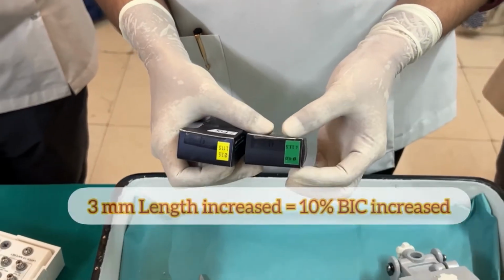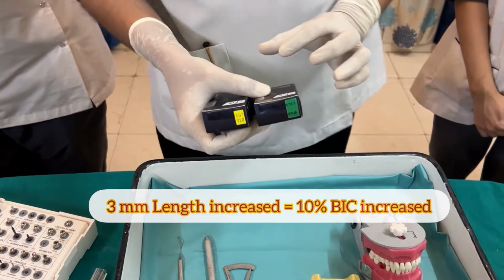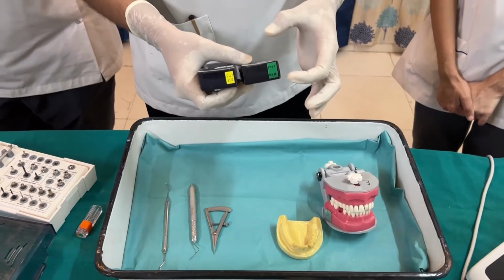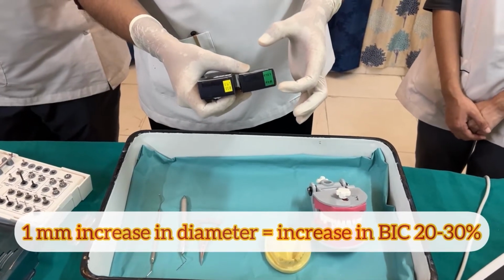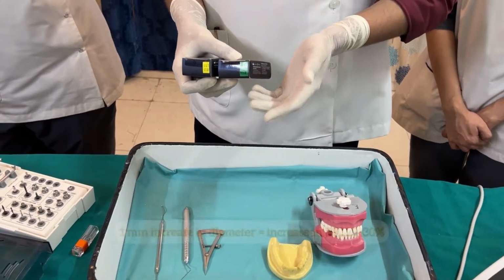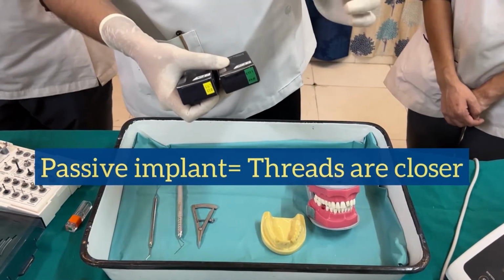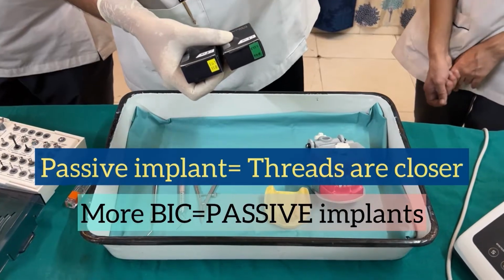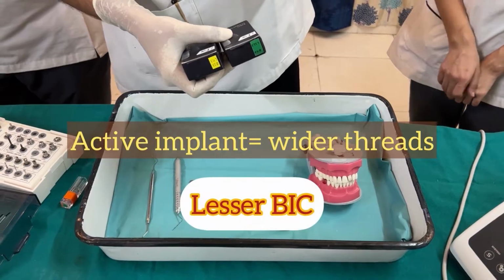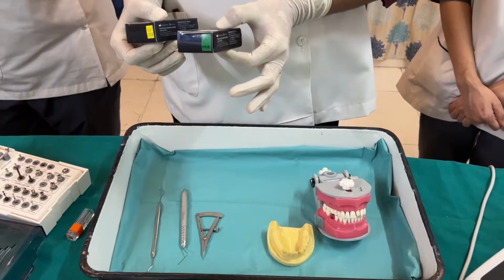So please understand that a 3 millimeter increase in the length of the implant increases the BIC by only 10%. On the other hand, just a 1 millimeter increase in the diameter of the implant increases the BIC by 20 to 30%, depending on whether it is an active implant or a passive implant. Passive implant means the threads are closer together. The BIC would be more in the case of a passive implant. An active implant means the threads are wider apart, the BIC would be lesser. So given a choice, which one will you choose? You will choose the widest possible implant if possible.